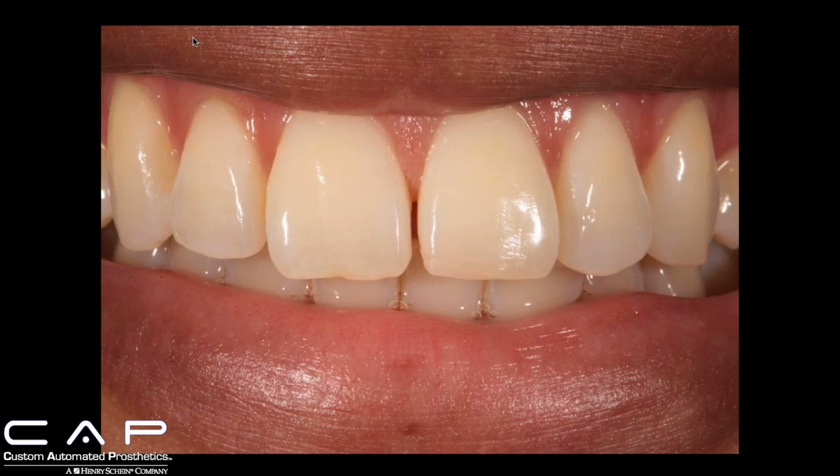So here's just a close-up photo of Elizabeth smiling. I always take one of these, a natural smile. In retrospect, I should have captured maybe the whole mouth, all of the lips. But you know what? Every case that I take photos of, or every case that I work on, at the end I always say, oh, I wish I had this photo, or I wish I had taken this angle.